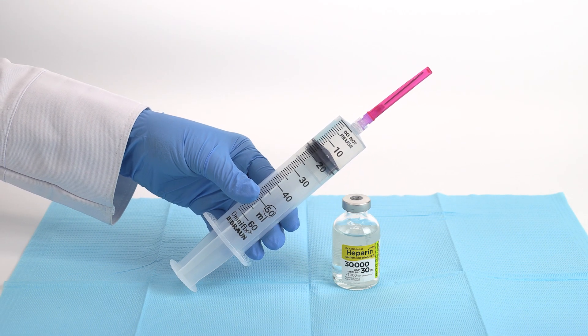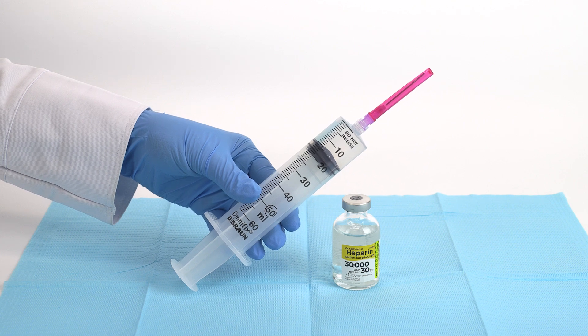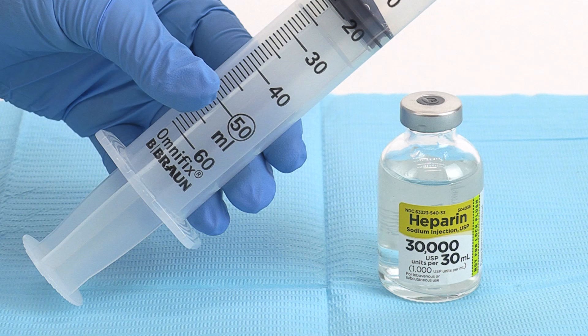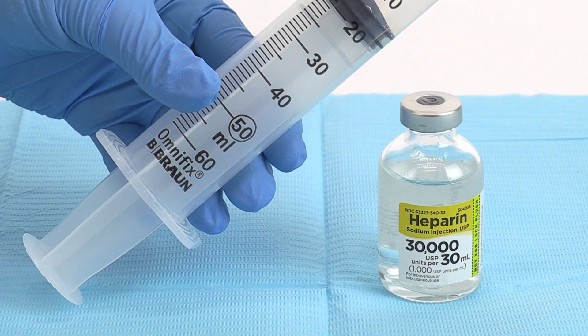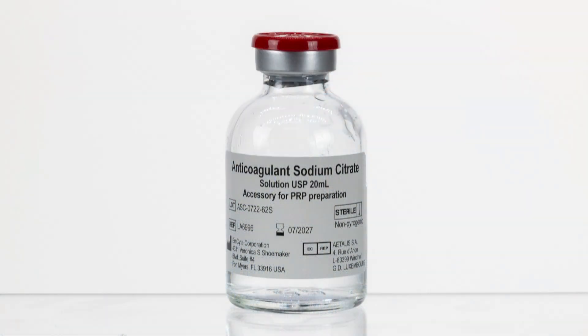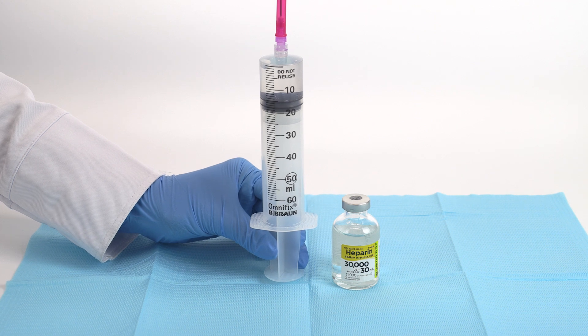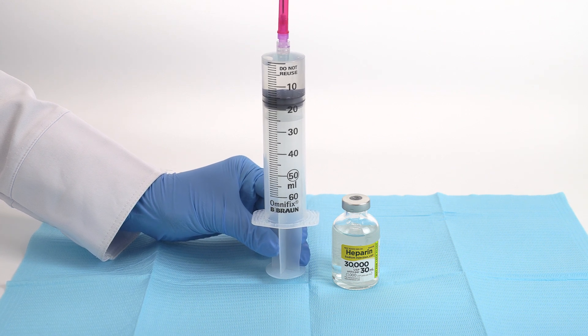First we will begin with priming the bone marrow needle and filter. Use heparin solution 1000 units per milliliter as the anticoagulant of choice. You may also use citrate anticoagulant if heparin is not available. To begin, aspirate 15 milliliters of heparin into the 60 milliliter syringe.